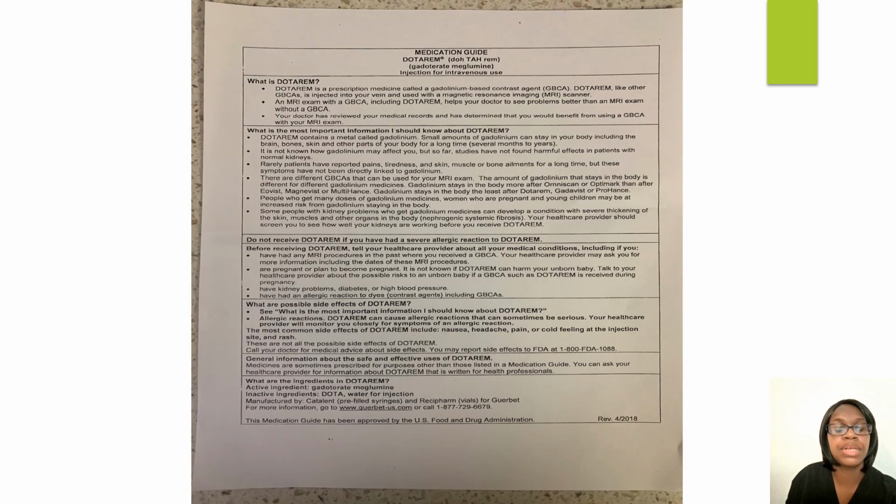At my facility, whenever a patient is having an MRI scan done, this form is given to them. It's going to go over Dotarem, what they should know about it, any side effects, allergic reactions to it. And you also want to make sure that the patient is drinking plenty of water after they have the scan so that they can flush the contrast out of their kidneys and their body.